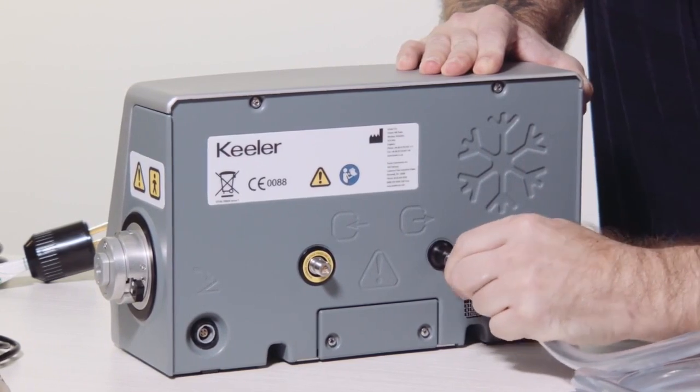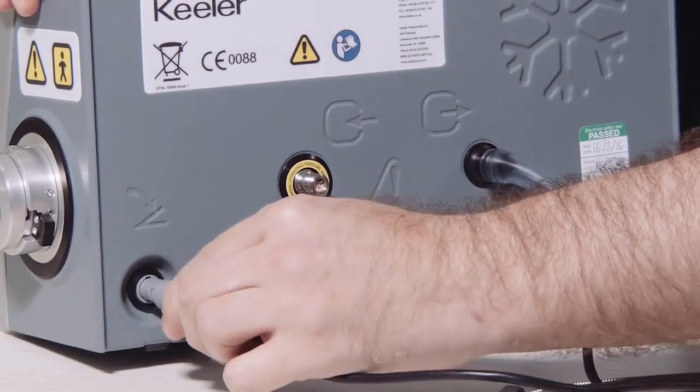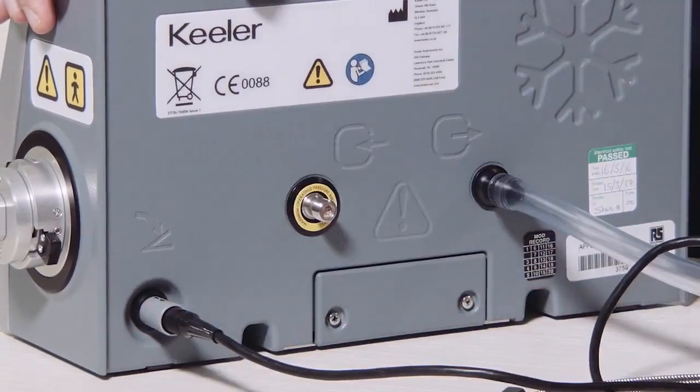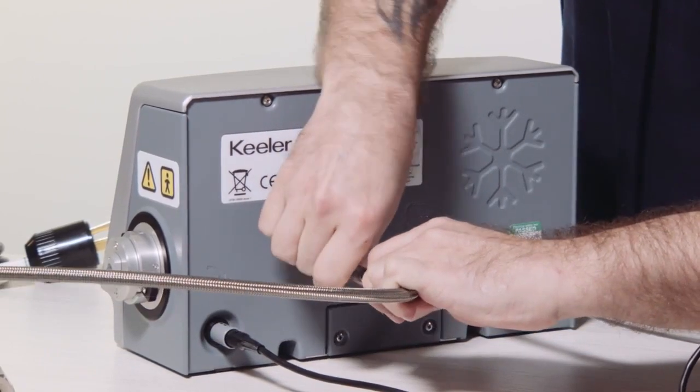Connect the exhaust hose from the gas exhaust to a ventilated area. Connect the foot switch to the console. Install the high-pressure gas hose to the inlet connector at the rear of the system.